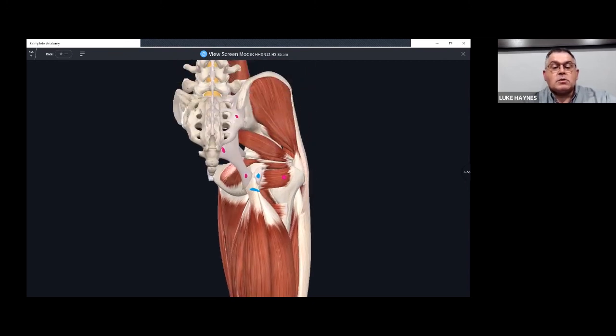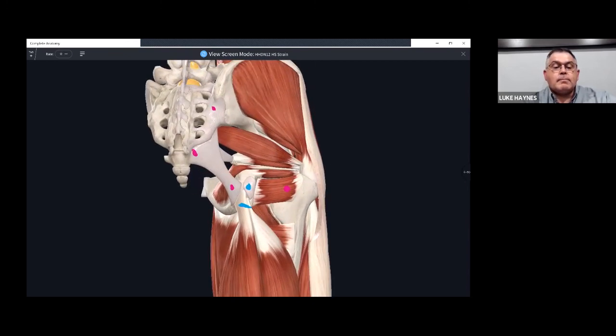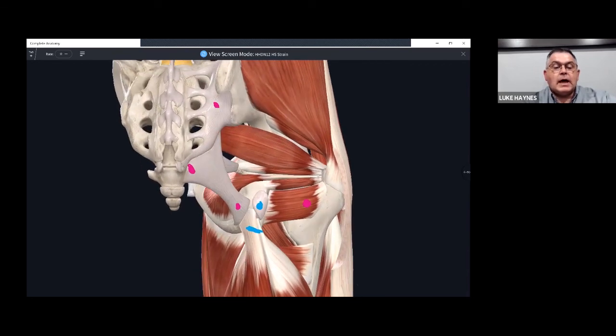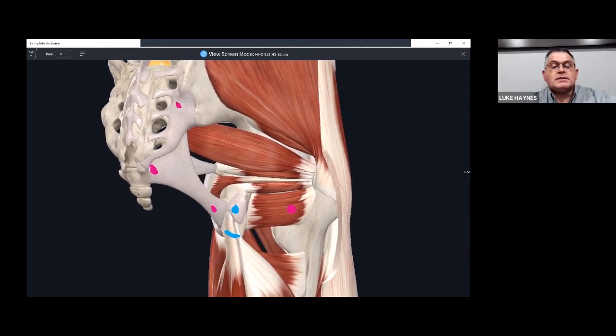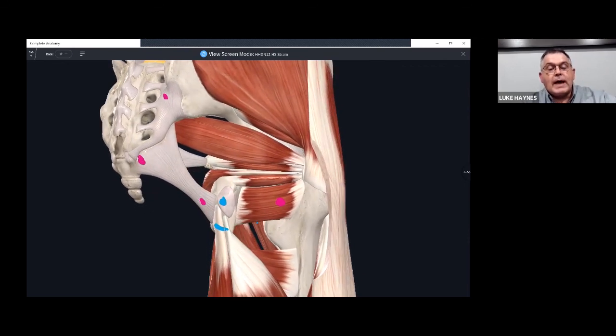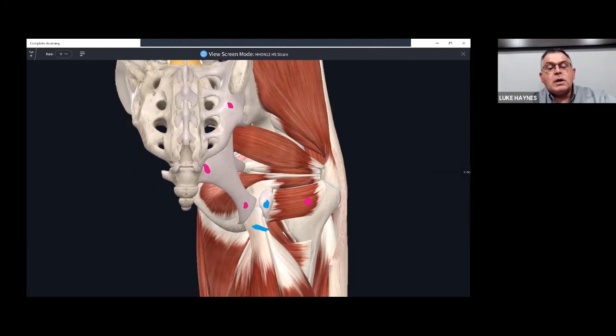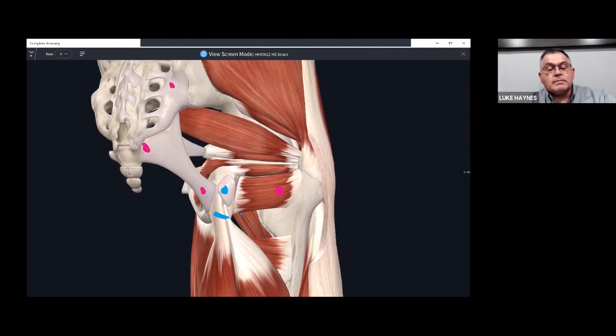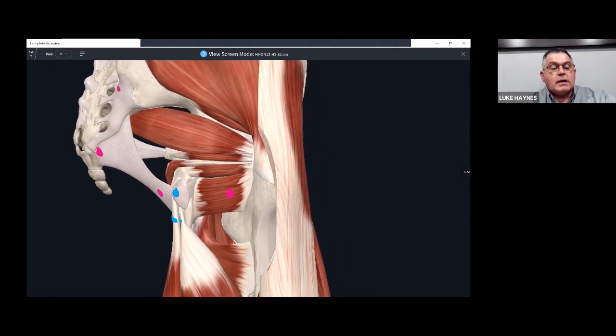Distally, we also want to come up, and because of their attachment on the ischial tuberosity, we want to hit that bursa of gluteus maximus. Again, sciatic nerve running right adjacent to it, and so we'll needle onto that. We can also needle into the proximal tendons of the hamstrings themselves. So needle through at that location.